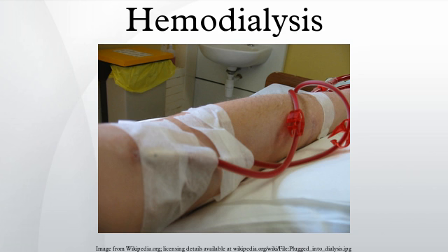Dialyzer size and efficiency. Dialyzers come in many different sizes. A larger dialyzer with a larger membrane area will usually remove more solutes than a smaller dialyzer, especially at high blood flow rates. This also depends on the membrane permeability coefficient Ko for the solute in question. So dialyzer efficiency is usually expressed as the KoA, the product of permeability coefficient and area. Most dialyzers have membrane surface areas of 0.8 to 2.2 square meters, and values of KoA ranging from about 500 to 1500 milliliters per minute.